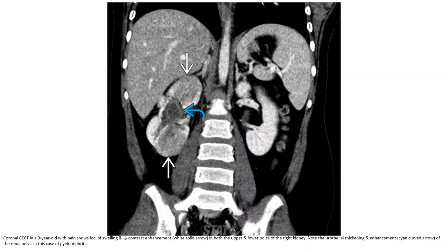Contrast CT in a nine-year-old with pain shows focal swelling and decreased contrast enhancement in both the upper and lower poles of the right kidney, with urothelial thickening and enhancement of the renal pelvis, in this case of pyelonephritis.